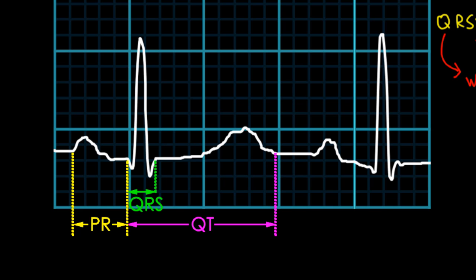Thus, the QT interval more than anything reflects ventricular repolarization, and processes that affect repolarization tend to have the greatest effect on the QT interval. It's important to know that at fast heart rates, the QT interval tends to be shorter, thus permitting a shorter refractory delay before the ventricles can fire again. Similarly, at slow heart rates, the QT interval tends to be longer.